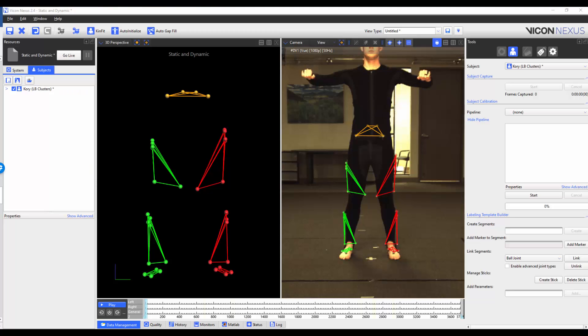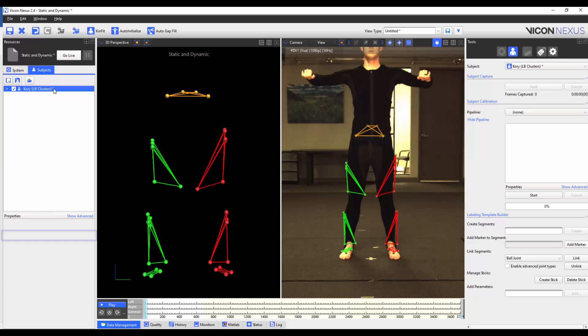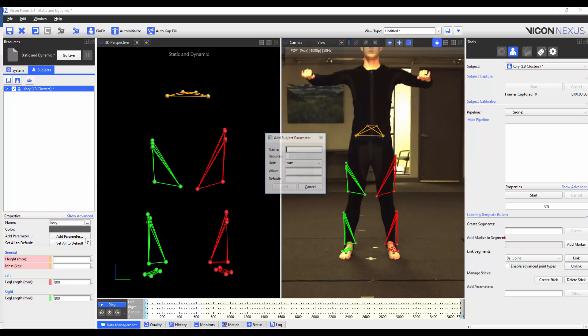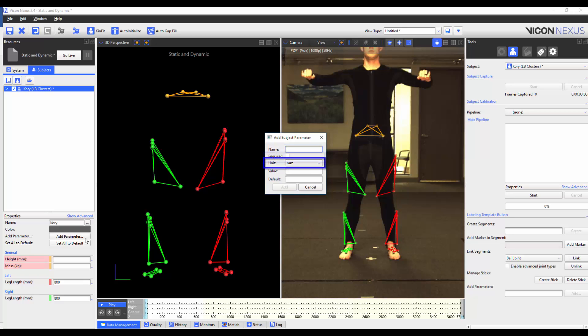Another feature includes the ability to add subject parameters. These aren't necessary for your labeling template, but can be stored in the VSK file, and these parameters can be referenced later if needed to perform modeling calculations. To add a subject parameter, we highlight the subject's name, and then press the Add Parameter button. This will open up a new dialog box where we can enter a parameter name, set the parameter to required, change the unit, enter in a pre-existing value, or to assign a default value.